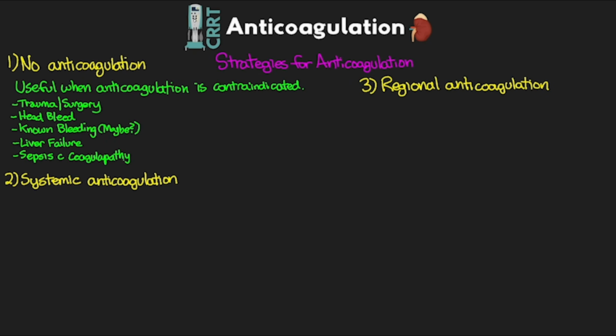Now, the major downside to a no anticoagulation strategy is really going to be the life of the filter, which is often pretty poor. And as discussed, the less downtime we have, the better this is. This may also require greater pre-dilution replacement rates, which is also going to decrease our efficiency.